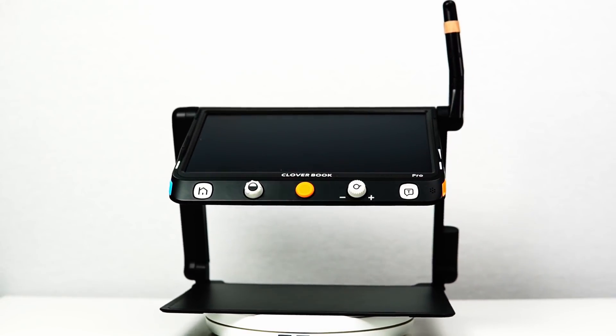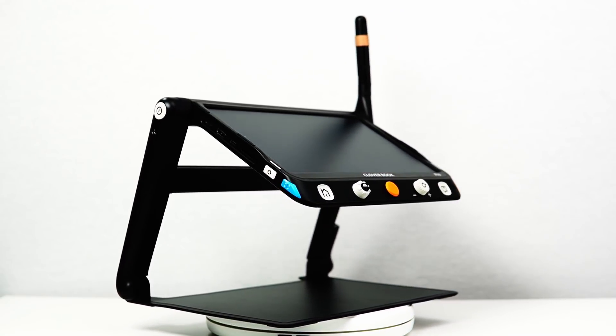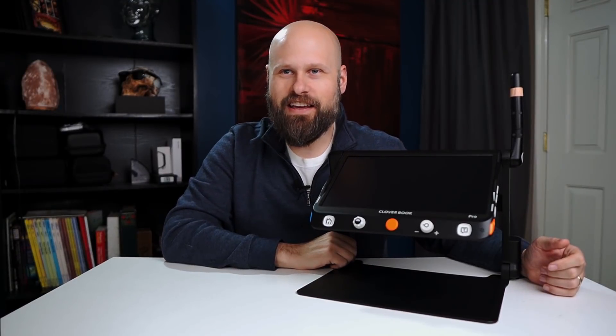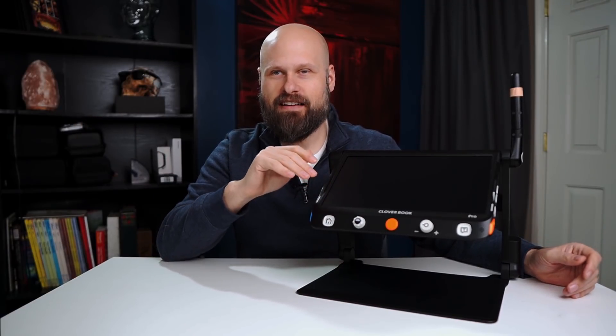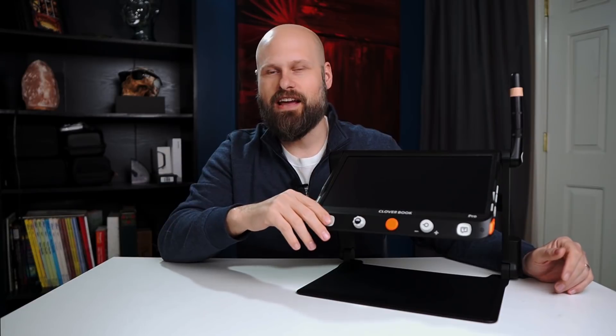This is the new CloverBook Pro brought to us by SightCare. This particular unit was sent to me by my friends at IRIE AT, so huge thank you to them. I know I like to save my opinions to the end of the video, but I'm going to go ahead and say it right now — I really, really like this device. In fact, I think it's becoming my favorite portable video magnifier I've ever tested on the channel.